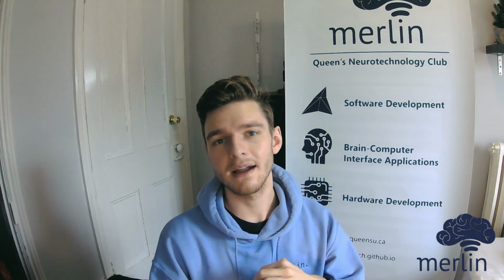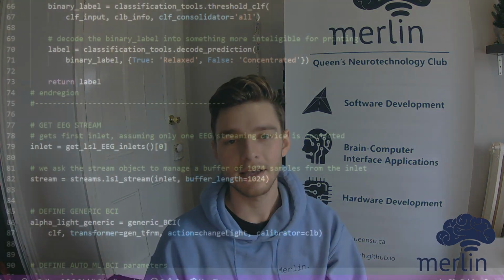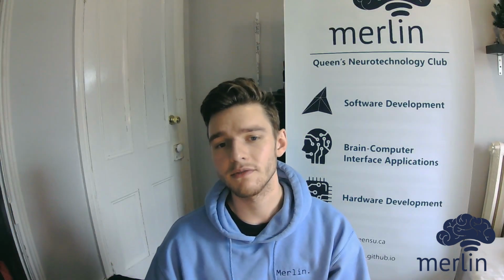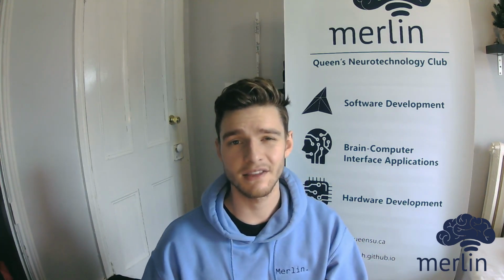So let's take a step back and take a look at the modular components from Neurol that made up this project. As we mentioned before, there's a sequential list of functions that are defined by the user and passed into the BCI class. First, we have the calibrator. Then we have the transformer. Next is the classifier. Then finally is the action, which takes the decoded state from the classifier. In the first version of AlphaLight, it used the general BCI script and contained the following structure.